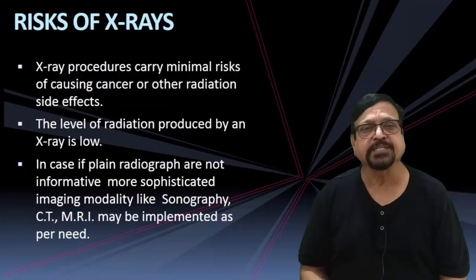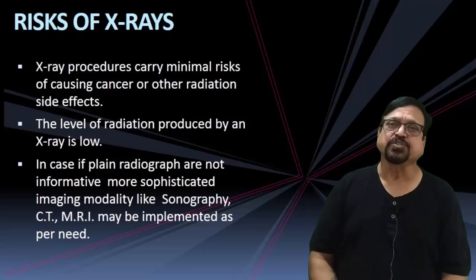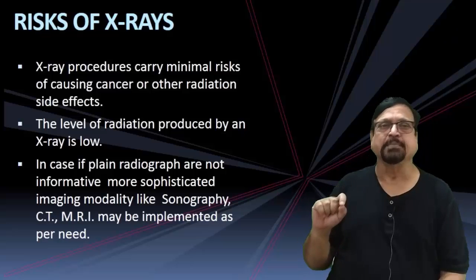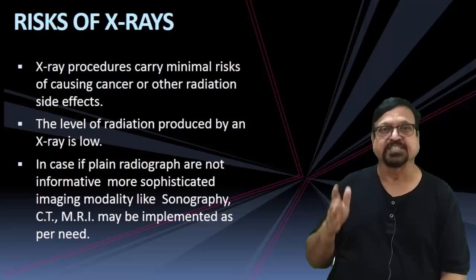Now, is there any risk from the X-ray? Theoretically, yes. X-ray is a procedure that carries a minimal risk of cancer, but I think it is too negligible, too minimal, and should not be considered against the benefit it is going to give us.